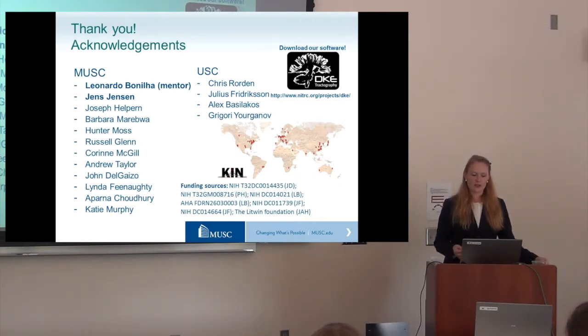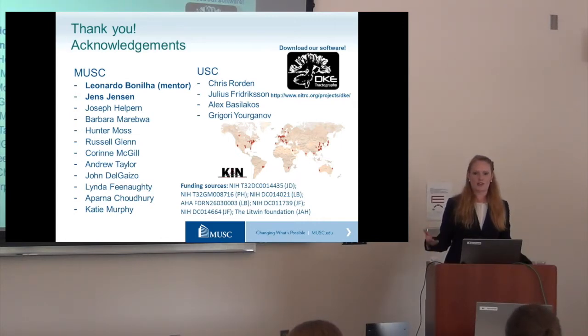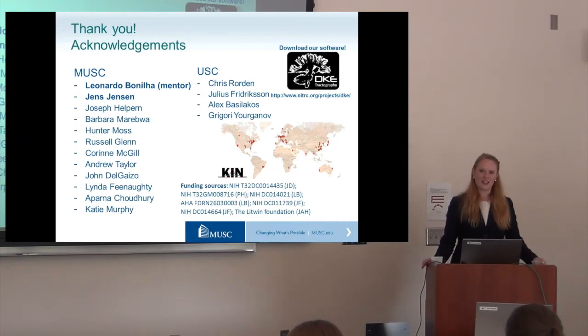We're also working on some newer techniques with even higher b-value scans called fiber ball imaging, that actually focuses on water coming from inside of the axon specifically. If some of the patients have a very large amount of edema or extracellular fluid, which can mask the tracts using our current techniques, we use higher b-value scans to draw out the signal from inside of axons, to improve the tracking. But it's tricky to get these newer techniques on patients, so it's something we've been working on.